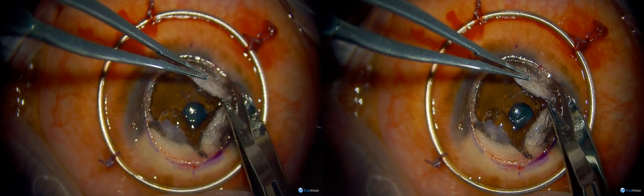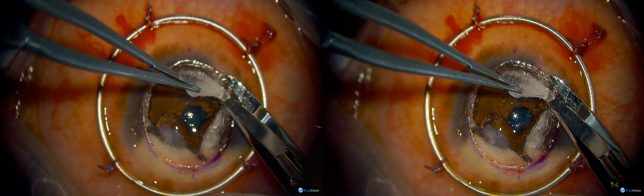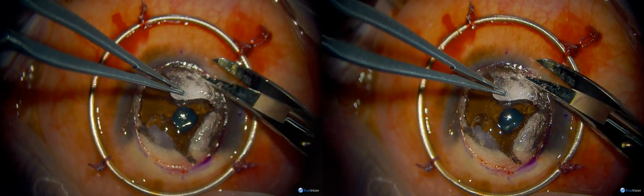She's removing the petals from the area of trepanation — this is the last step — and you can see how clear the underlying Descemet's membrane is. It's probably a type 2 bubble.